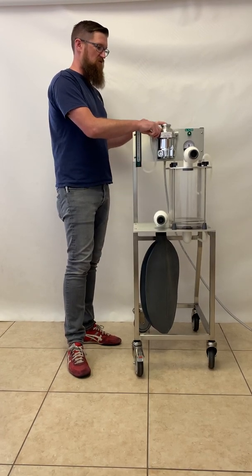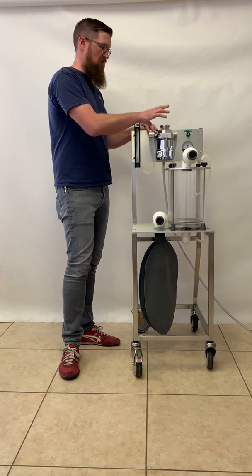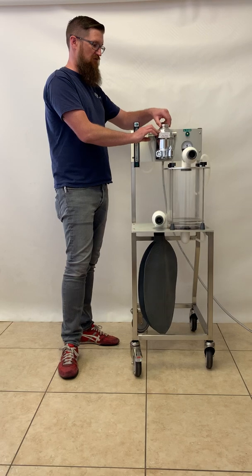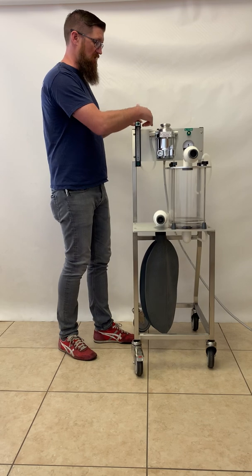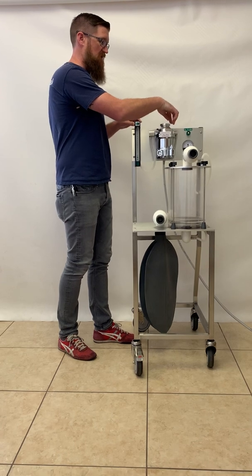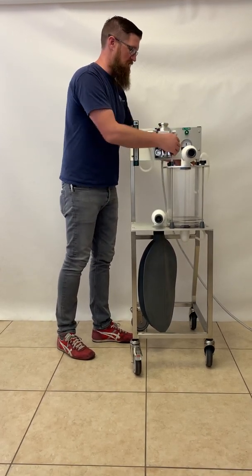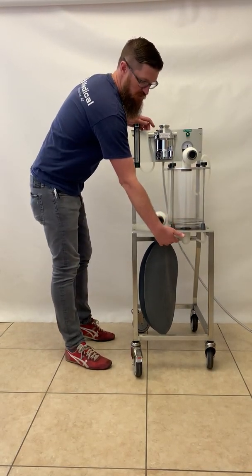This is a TEC-3 vaporizer. You have a slightly different style of vaporizer, but it still operates on the same principles. You set your percentage of isoflurane by adjusting the dial, and the gas will flow through the vaporizer, pick up the vaporized anesthetic gas, and come out of the vaporizer into the fresh gas line that comes down and enters the circuit underneath the machine.